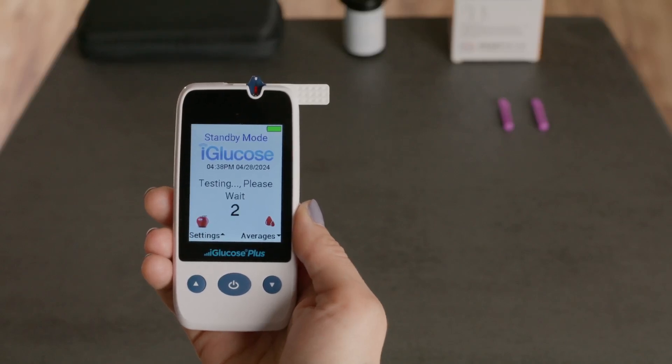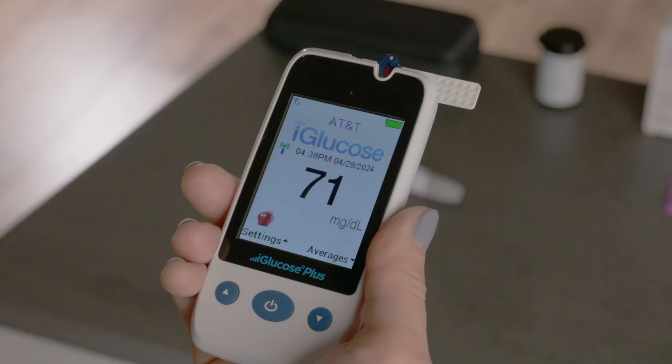The meter will count down from 5 to 1. Your blood glucose results will then be displayed and automatically stored in the meter's memory and transmitted to your care team via cellular network.